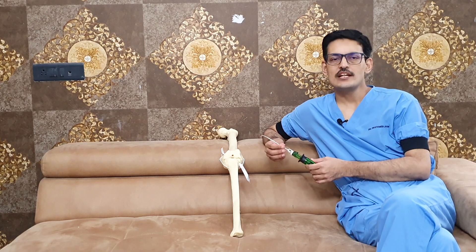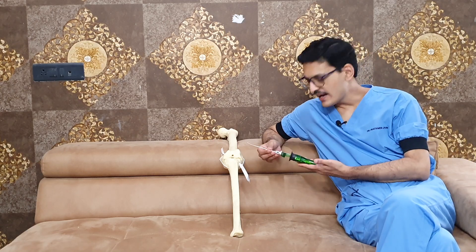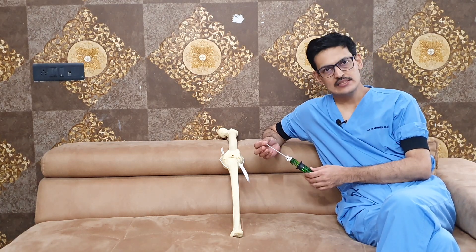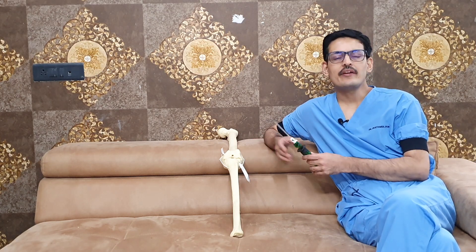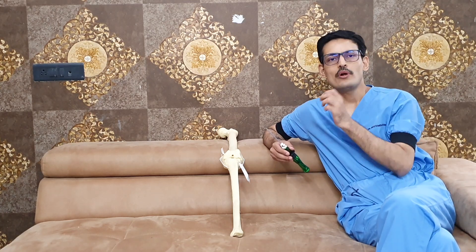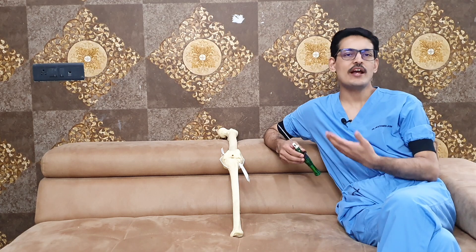I call it the recent most advanced meniscus repair technology. This device is available in two sizes: one straight and one curved. There are two blue-colored anchors which are made entirely of suture, and they are connected with a 2-0 UHMWPE suture — that is ultra-high molecular weight polyethylene suture — and they are connected with two loops: one is a striped blue loop and another is a white loop.